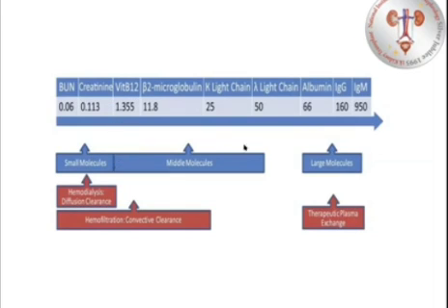The other middle molecules, which are very important also in the inflammatory process, can be removed by hemofiltration, by convection clearance, and these substances have bigger molecular weights than urea and creatinine.